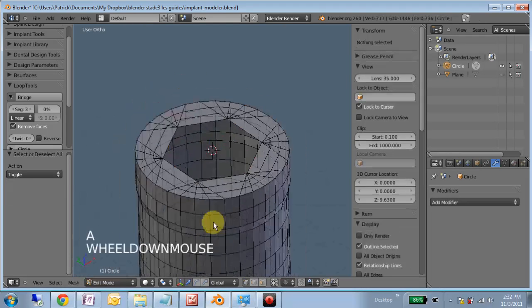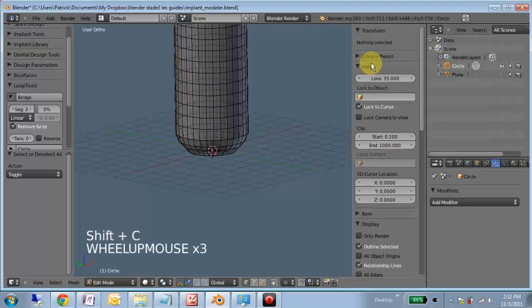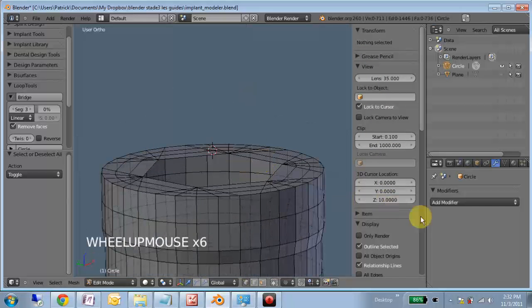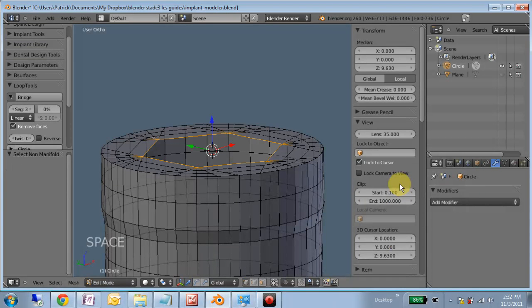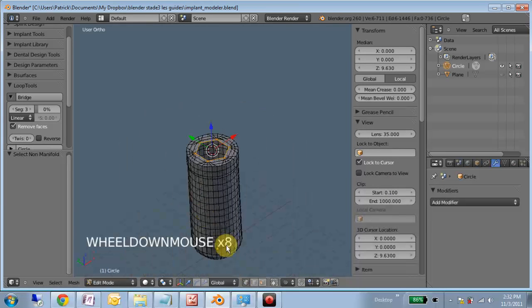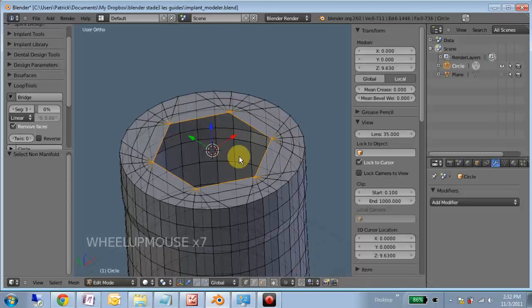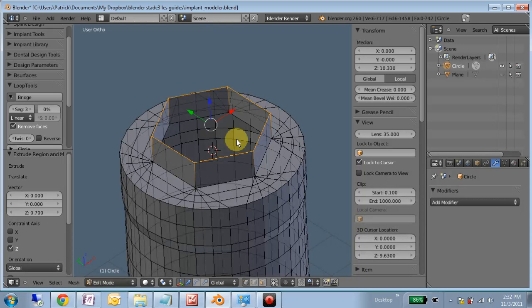So because we filled in the bottom here, if I select the non-manifold edges, it will just select this hex here. If I had left the bottom open, it would select the ring down there. I'm going to hit E to extrude, Z to limit it to the Z-axis, and type 0.7 since that is the height of our hex.